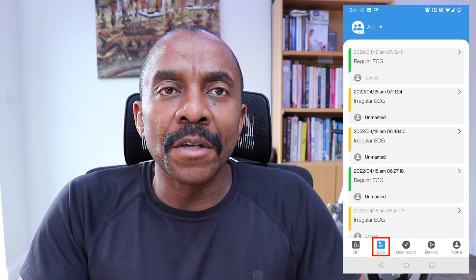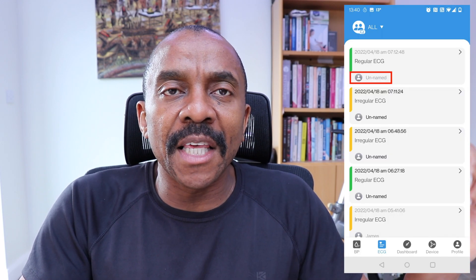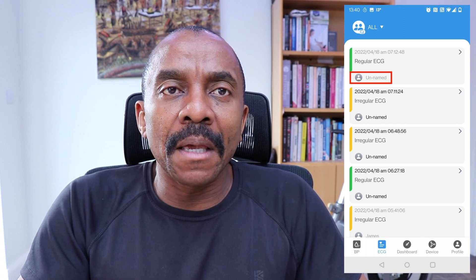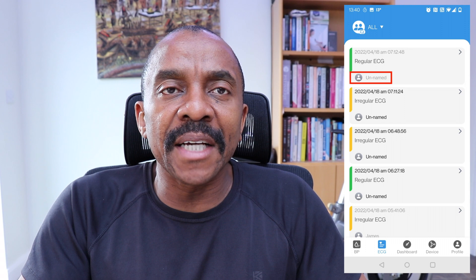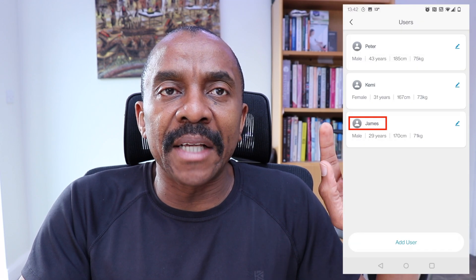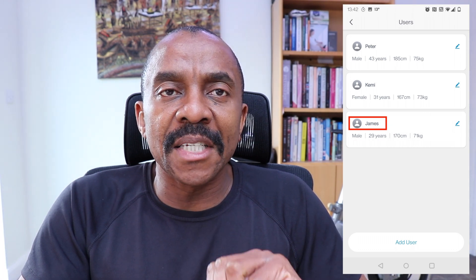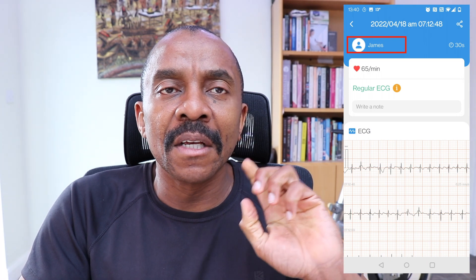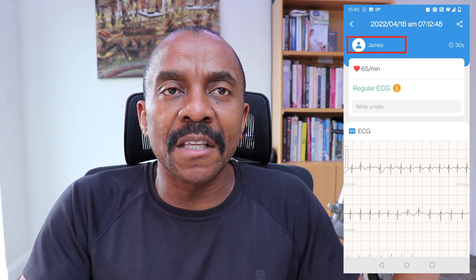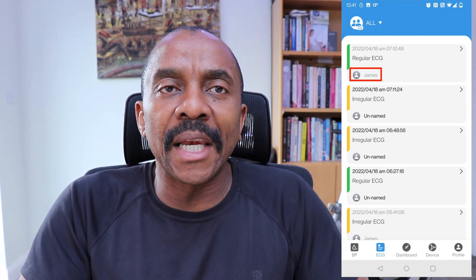The same applies to the ECG readings. If you tap on the ECG icon on the app, the interface looks like this. You can then select a particular reading that hasn't been assigned and the interface would look like this. Tap on named and select the user — choosing James as an example — and the interface then looks like this. If you go back to the main ECG interface, it would look like this.